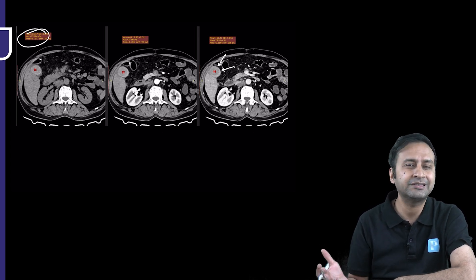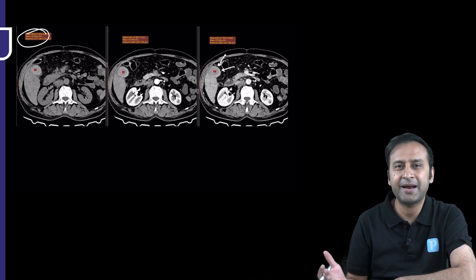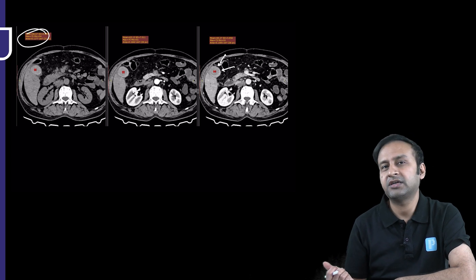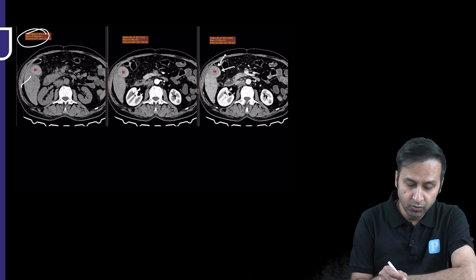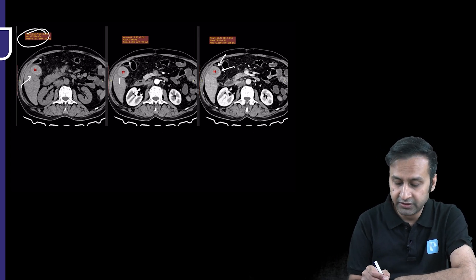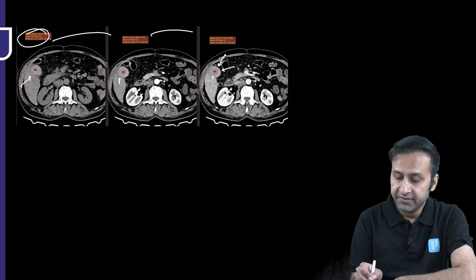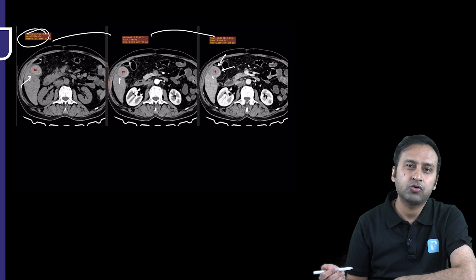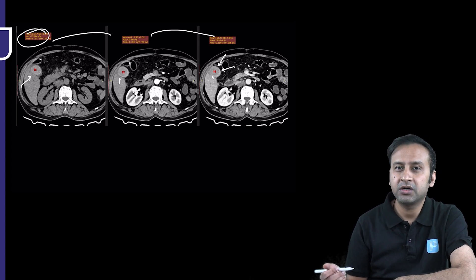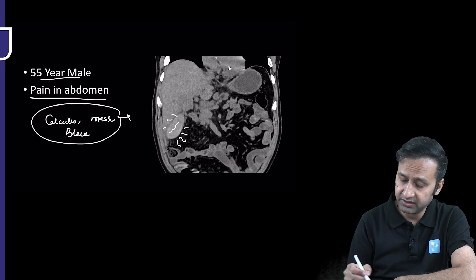In day-to-day CT reporting practice, we tend to look at the contrast study first. I initially thought I was dealing with a mass. But when I looked at the non-contrast phase and compared the densities, they were found to be identical across phases. This was a non-enhancing structure seen throughout the gallbladder lumen.